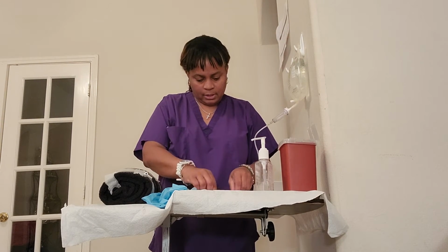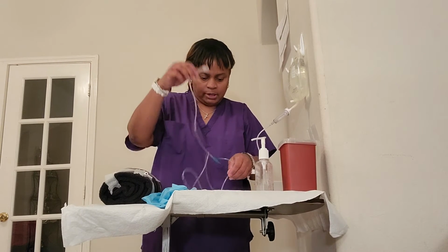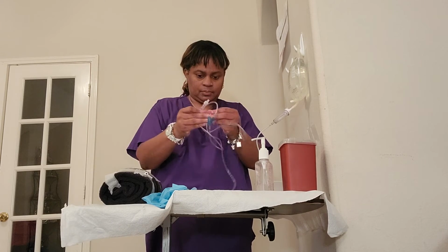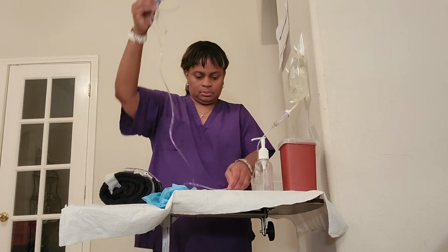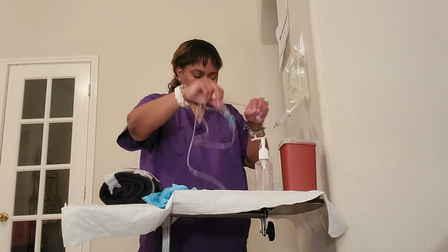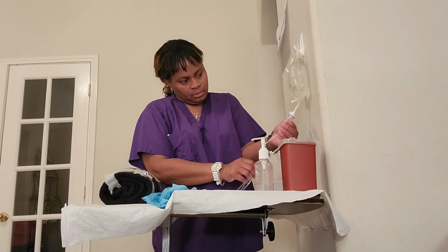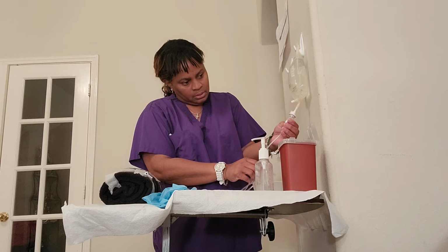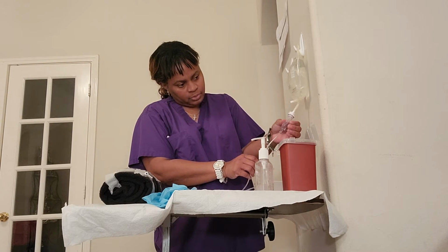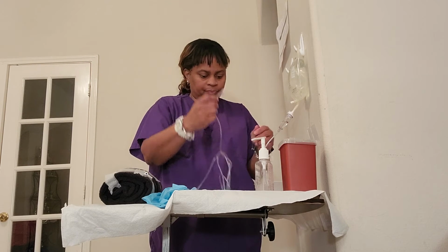Okay, I am now going to prime my tubing. And I have a receptacle here. So I'm going to squeeze the drip chamber one good time, and we're going to do it once more because we at least want it halfway. Okay, so it is halfway filled.